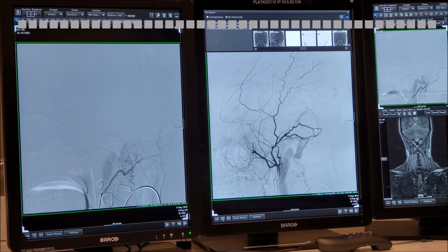Fellows, the first thing I guess is that there is not a single fistula. That's why I gave you two images. This one shows that there's this network here, and this one shows the network here. So the superior and inferior parts of the sinus both have fistula drainage. With transvenous, you can do something very simple: just close the sinus and get rid of the fistula.